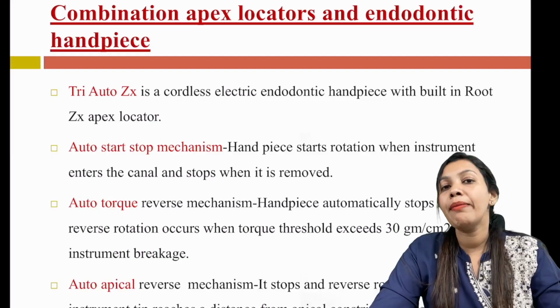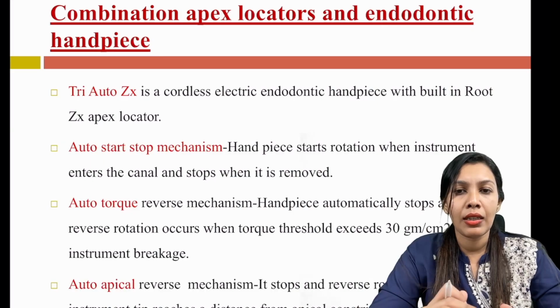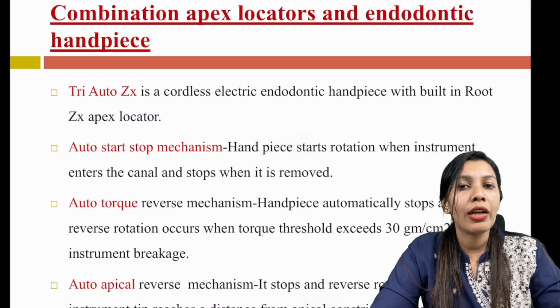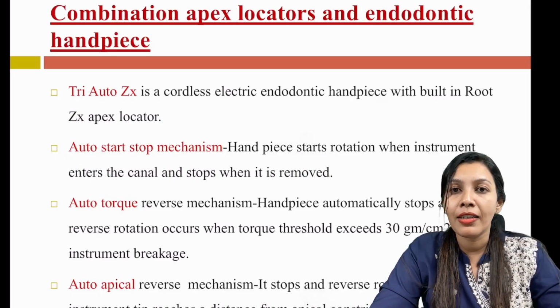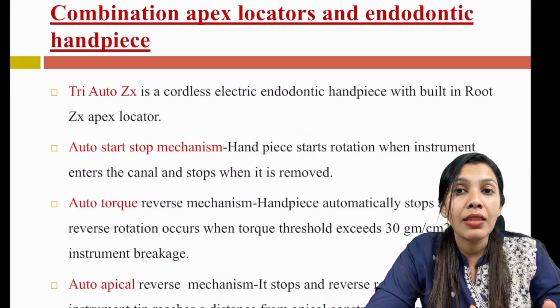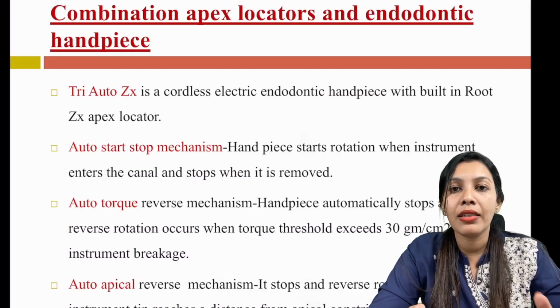So this is a very important topic, working length determination. You need to know the range from which the working length is determined, the various radiographic as well as conventional methods, and the various electrical apex locator methods, and just memorize RIF: resistance, impedance, and frequency.